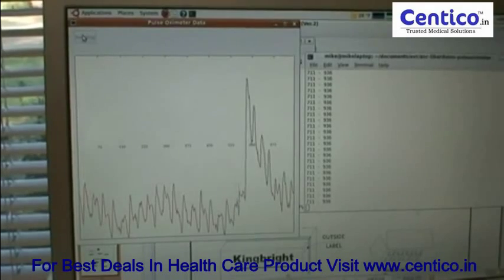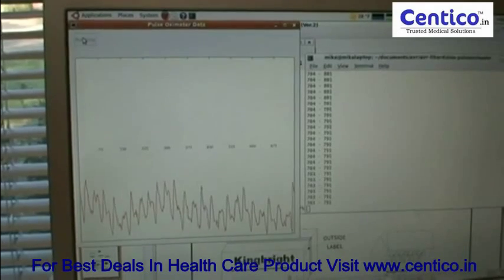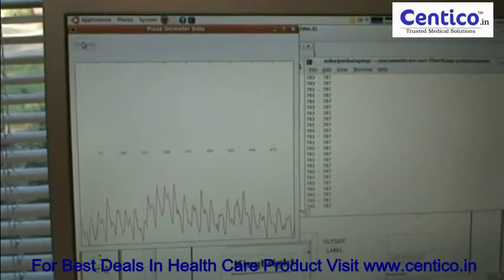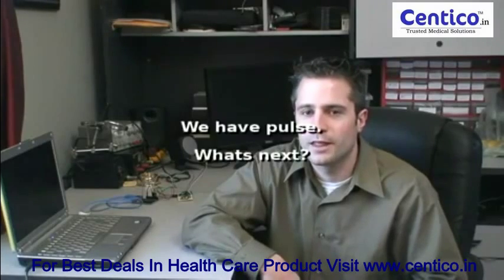What you're looking at right now is a graph of the light absorption from a red LED. As my heart pumps blood through my body and into my finger, you can see that change over time and you can see my heartbeat. One of the next steps is to write some software to detect these beats and calculate the heart rate.